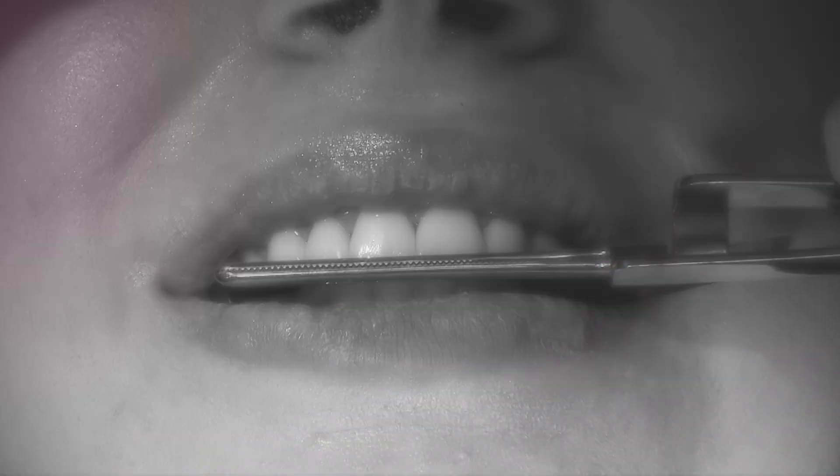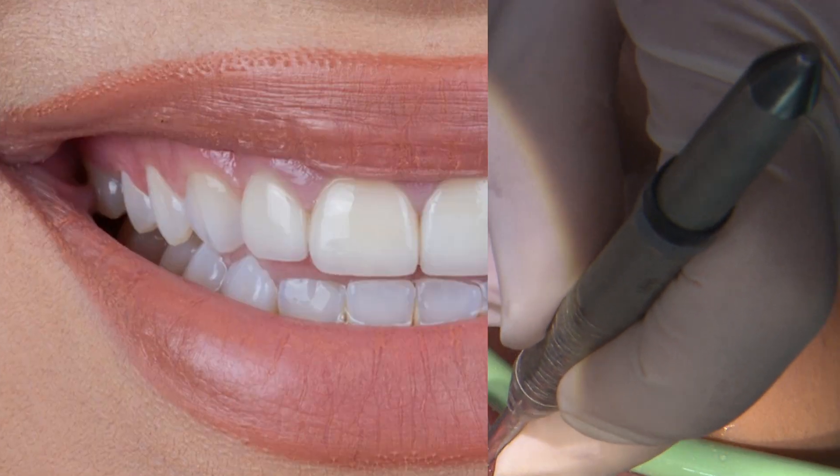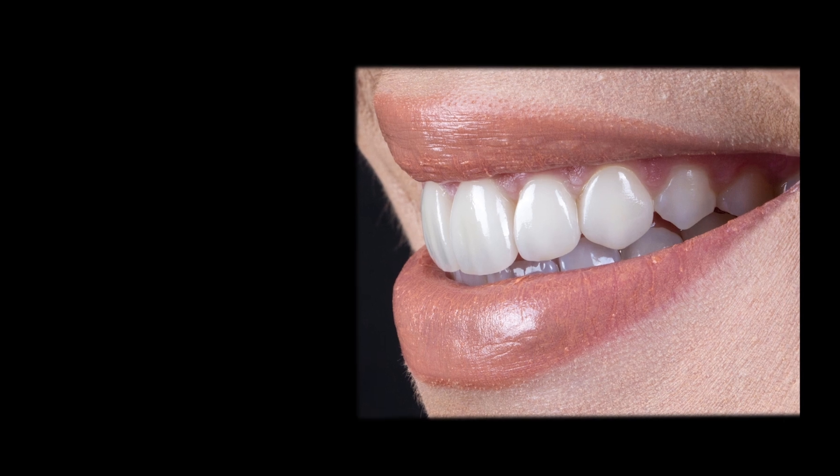At the end, I dial in the occlusion and also smooth out any rough areas along the lingual margins with a fine grit diamond burr. The outcome provided a great aesthetic improvement that I think fits the patient really well.